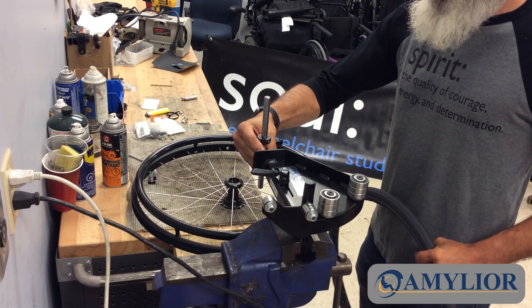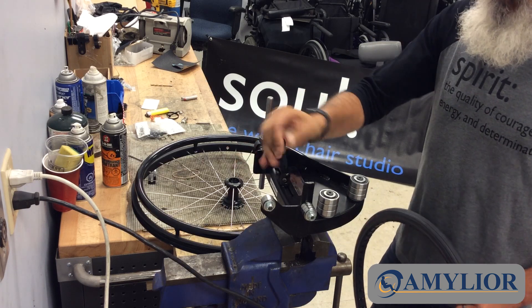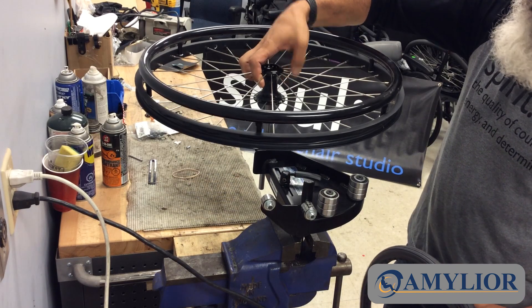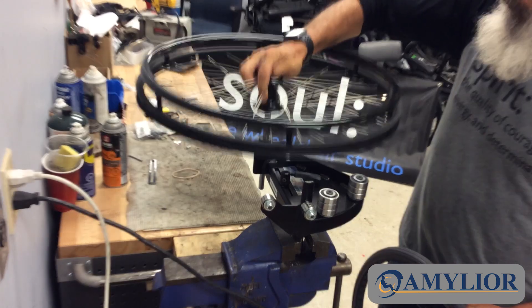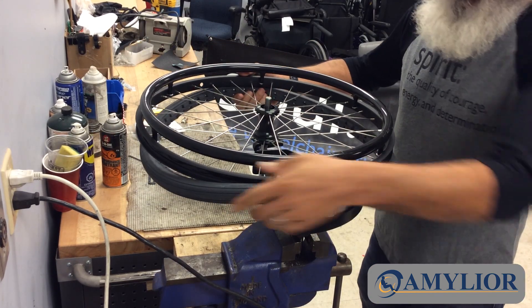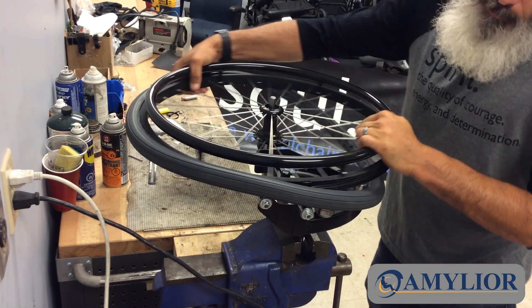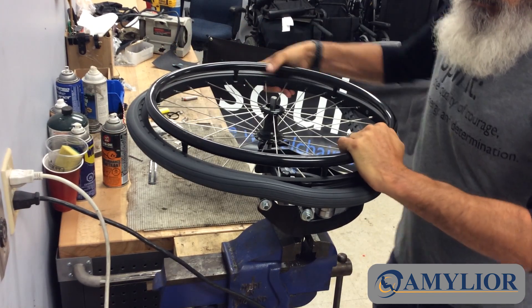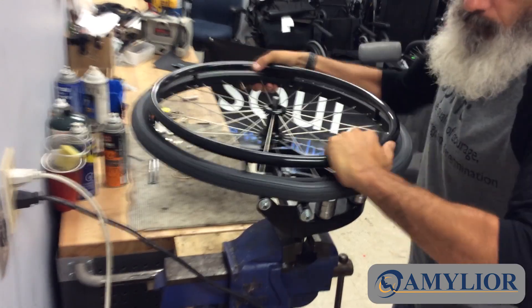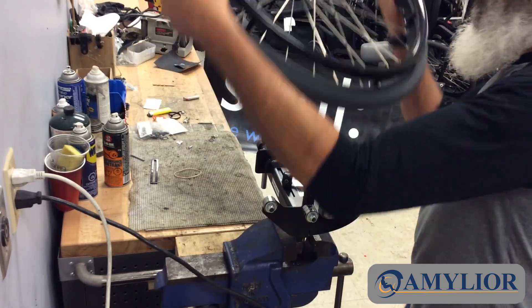All right, here we go. So we've adjusted for the depth, or the size of the rim. I'll put the tire on — solid urethane. Notice that it's only one person doing this. And there we go.